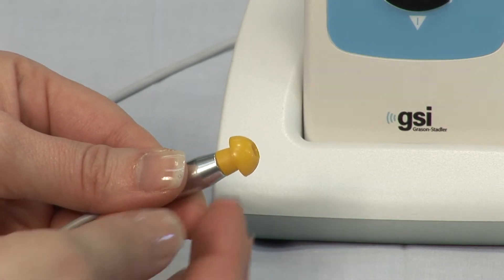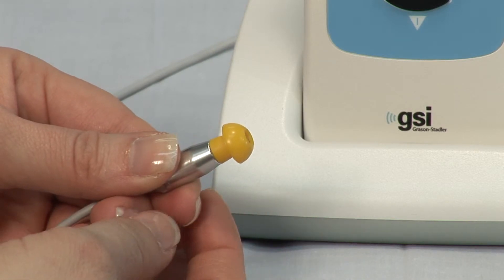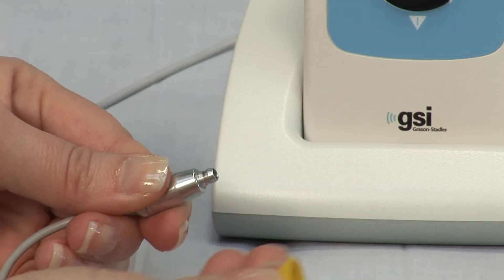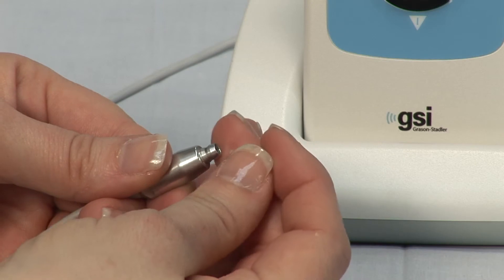To replace the probe tube, grasp the silver probe body firmly with one hand. Use an ear tip to grip the probe tube and gently pull off the probe and discard. Place a new, unused probe tube onto the end of the probe body.